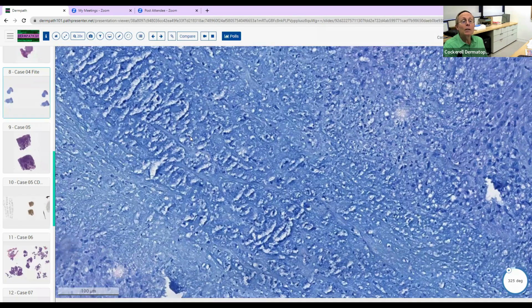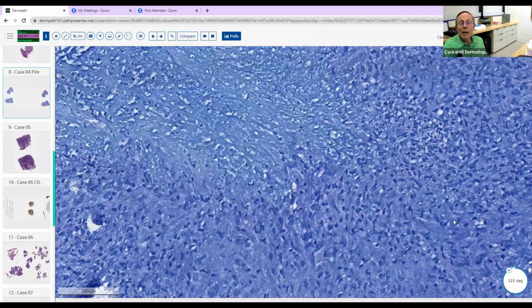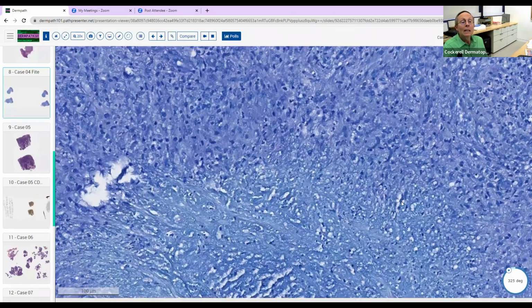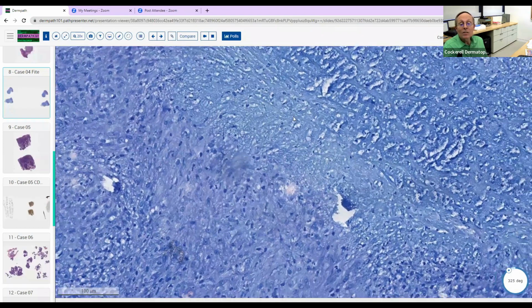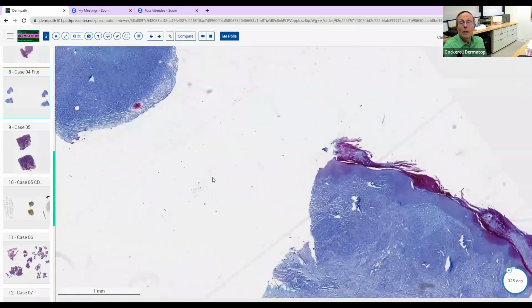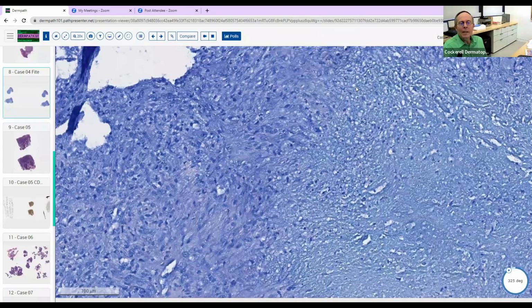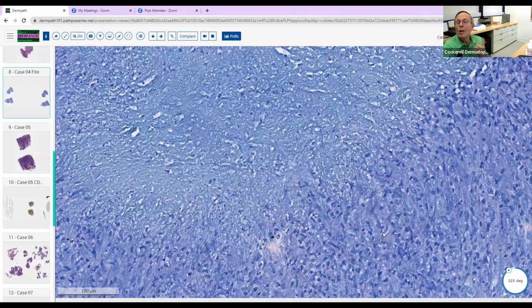And if you're going to look for the organisms, always look in the caseation areas, and you have to kind of search around. Then you want to look in the granulomatous areas here as well. It's what we call going on a bug hunt, and you have to sit here and look for it for a while. I believe there were organisms in here. It's not as easy to see on the scanned image. I know we saw them because we made a definitive diagnosis in this case. Were you guys able to find them in here? I wasn't able to see any, but I know sometimes there can be very little. There can be. In fact, you'd be surprised. Sometimes you'll see an infectious granuloma like this, and you might see one organism.